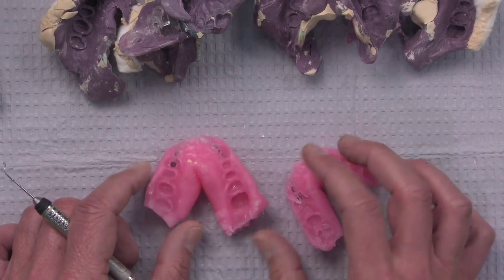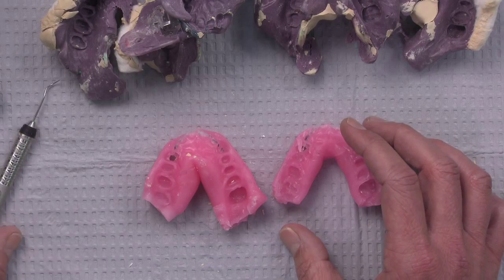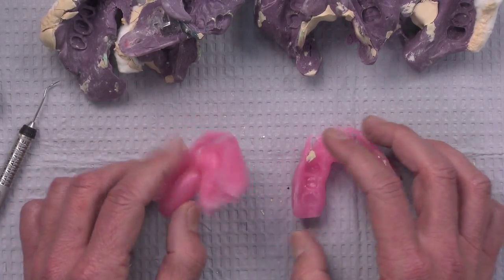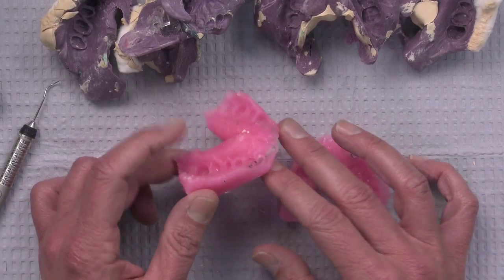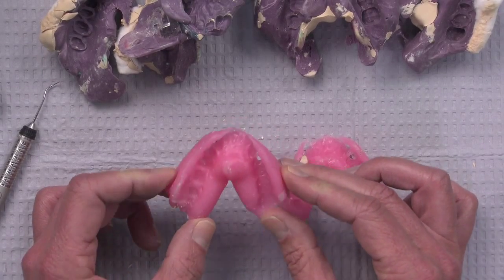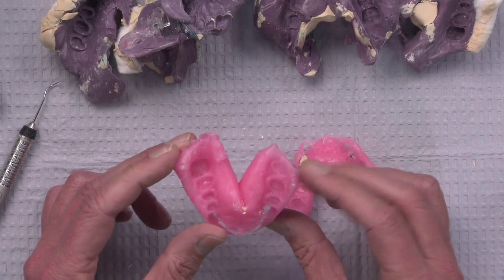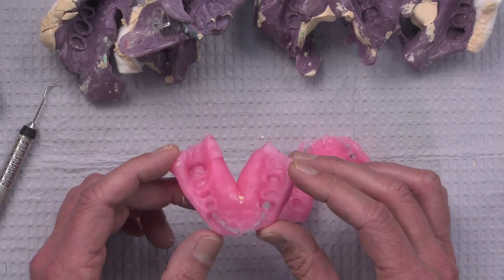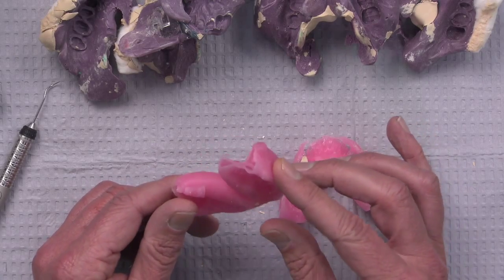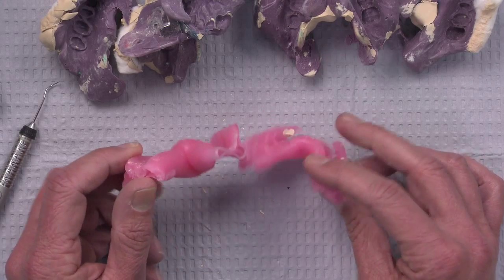This doctor is in the eastern United States, and so these were flown across the country, and we definitely see distortion. Now, he did make it nice and thick. I appreciate the fact that they're nice and thick, because they're much less likely to distort when they're thick like this. It's when we have one single sheet that it's a little difficult to do, but the patient sometimes has a hard time closing into this thicker wax. So if you're going to do a wax bite, this is the way to do it. You can see how many sheets are rolled all the way around there.